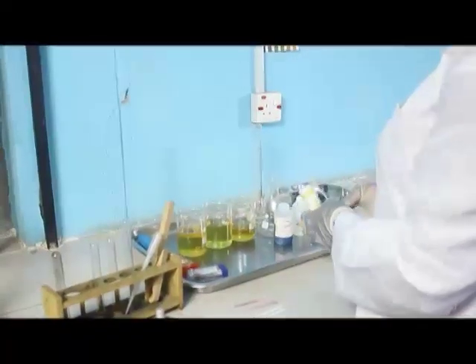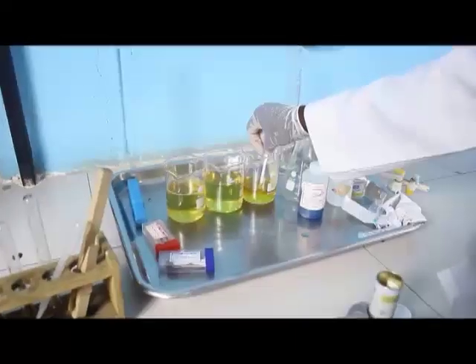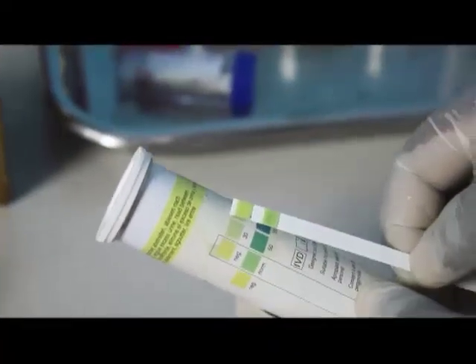To test for albumin, use Albustix. The test end of the paper is dipped into the urine and removed immediately. The color is compared with the color chart provided on the bottle to determine the amount of albumin.